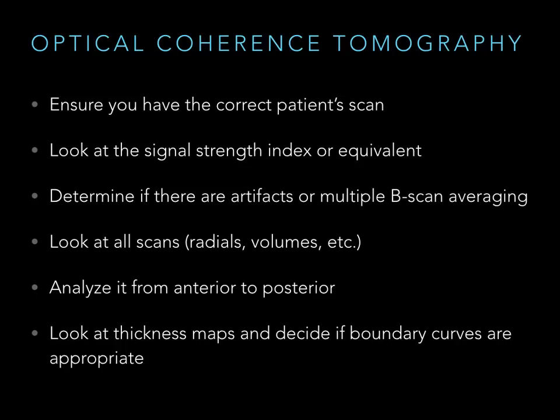Analyze it from top to bottom. Be somewhat like you are when you look at a color fundus photograph. You talk about the media, you talk about the optic nerve, the vessels, macula, et cetera, et cetera. You want to do the same thing with OCT. You want to have your standard algorithm.